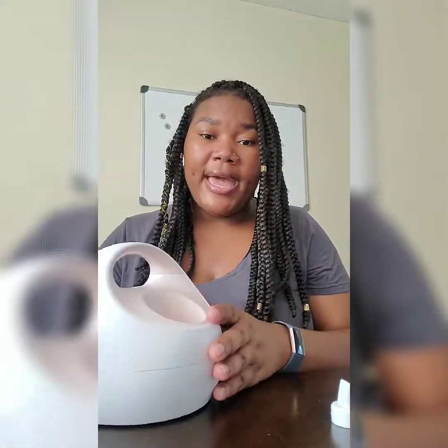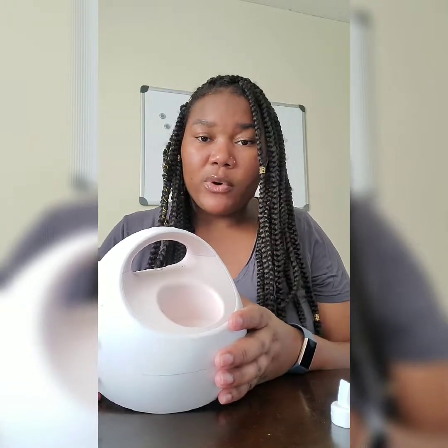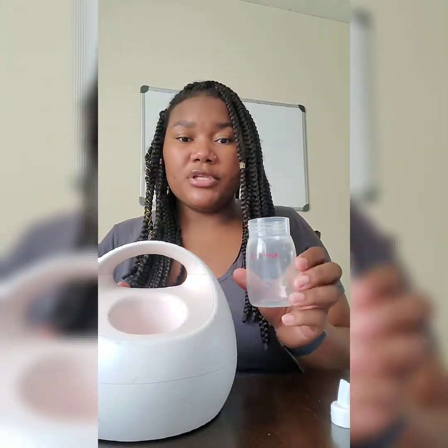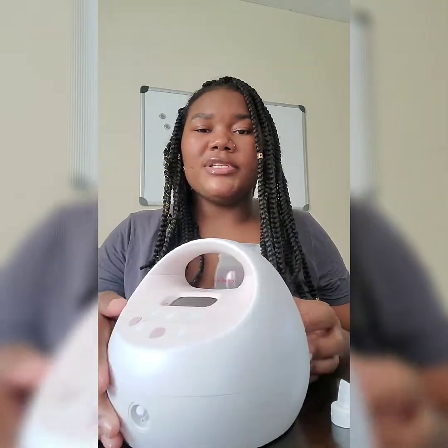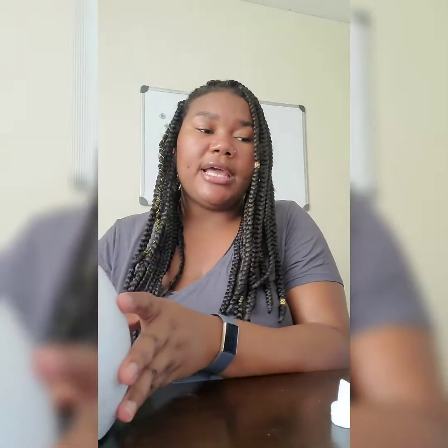The Spectra has a spot on the back of it to actually hold the bottle. So if you finish with one bottle and want to switch to another — you get two Spectra bottles with the starter kit — you can set the finished bottle right there without having to get up. I thought that was a nice touch since I tend to knock things over. They also have different flange sizes, which matters because not everybody has the same size areola or nipple, and it does make a difference in the quality of your pumping.